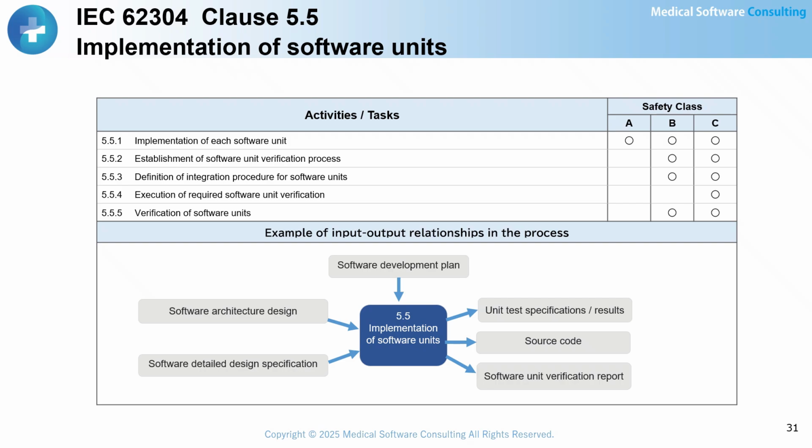E. Initialization of variables. F. Self-tests. G. Memory management and prevention of memory overflow. H. Handling of boundary conditions. Finally, the verification of software units must be carried out according to the Software Unit Verification Plan, and the results should be documented in the Software Unit Verification Report.